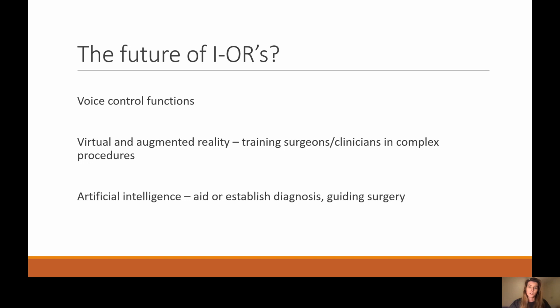So this is being looked at in training surgeons and clinicians, especially when there's a complex case and they might need to be able to practice beforehand so that when they come to the actual surgery, they are well prepared. And finally, artificial intelligence. This will be used to either establish diagnosis or in the future, maybe even used in guiding surgery.